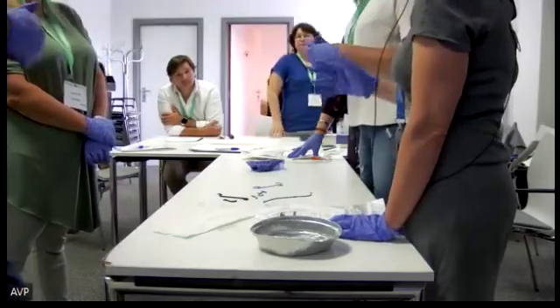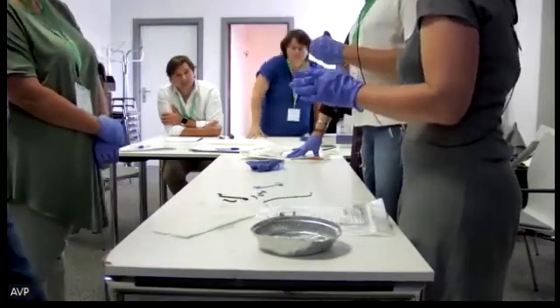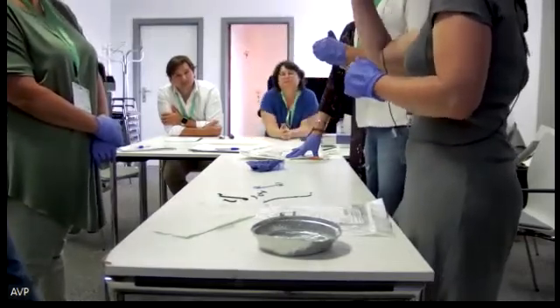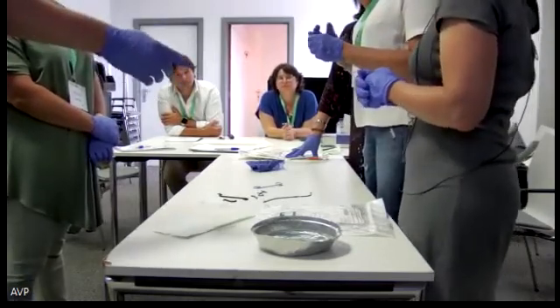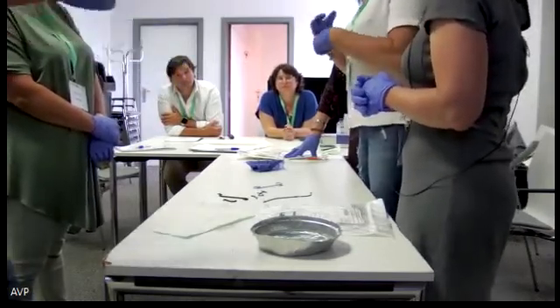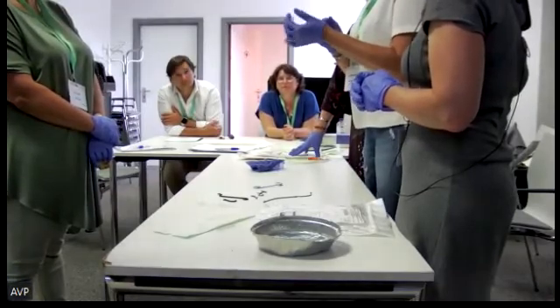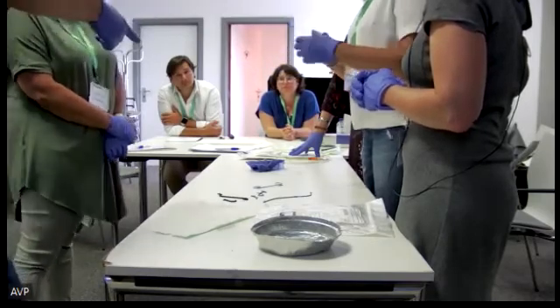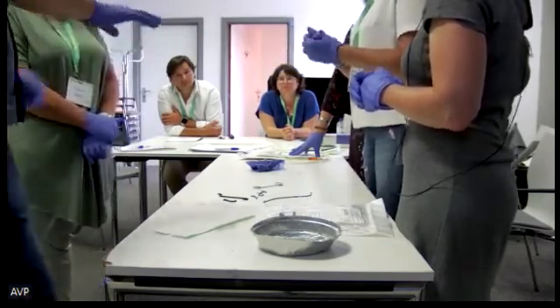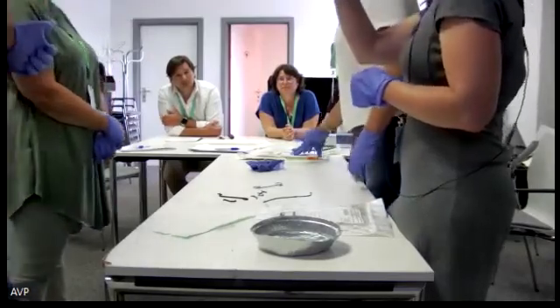Yes, the torquing is to navigate inside the difficult stricture or to choose the good intrahepatic bile duct. We sometimes have a problem when trying to cannulate the right bile duct. This is probably good for us because we can just turn it. Yes, you need an angle-tipped guide wire for that.